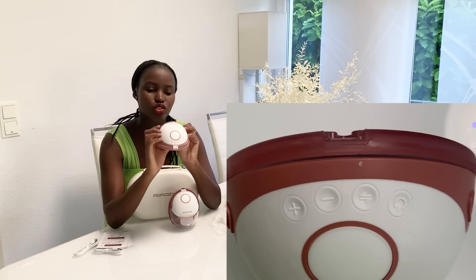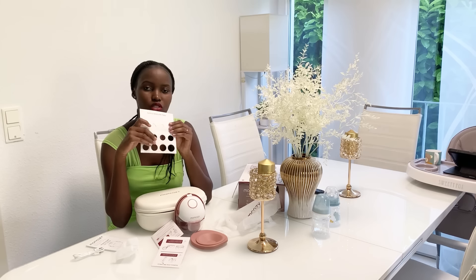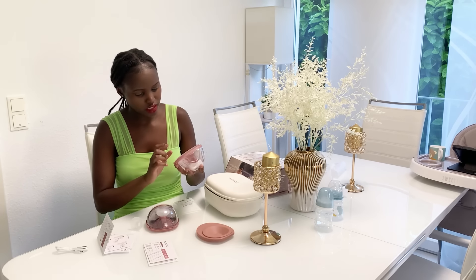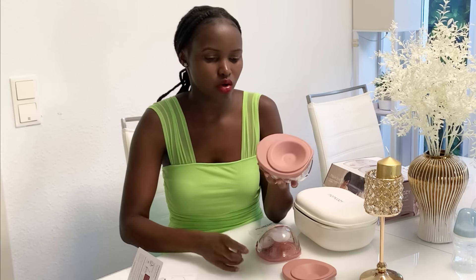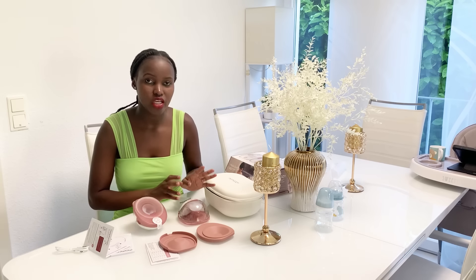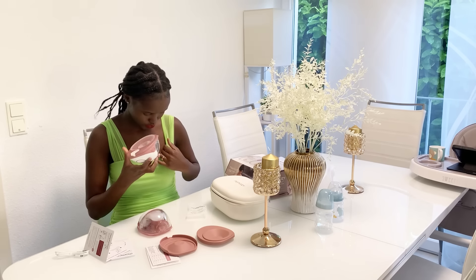There is a power button, a button to increase suction, and a button to decrease suction. Do not open the flange to pour milk. There's also a nipple measurement tool — you're supposed to measure your nipples and choose the right flange. I'll use the 17 millimeter flange insert. I'll insert the flange on this side too. If you don't do it correctly the suction won't work as it's supposed to, and that will interfere with pumping. I already charged both of them; let me go rinse them before I start.